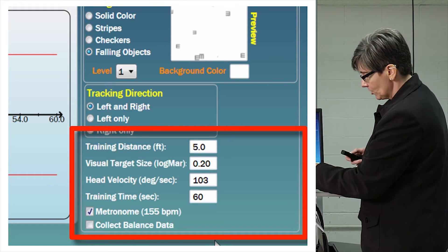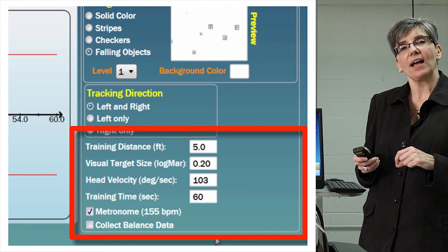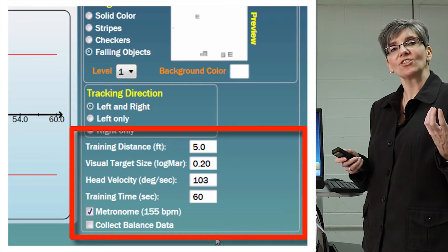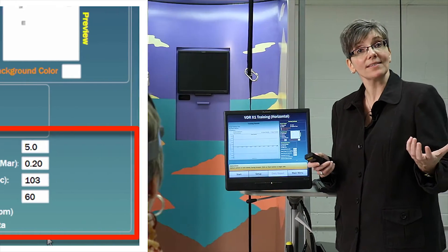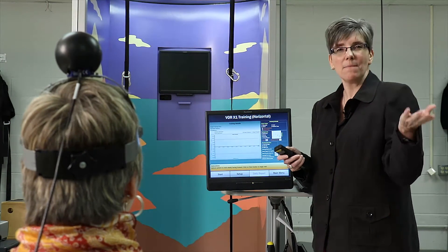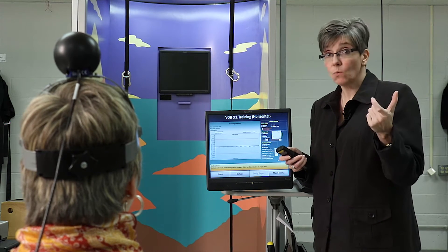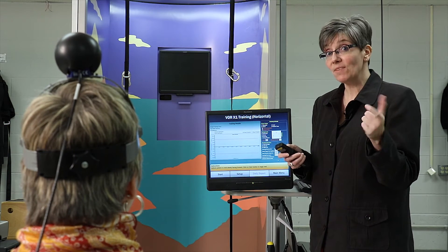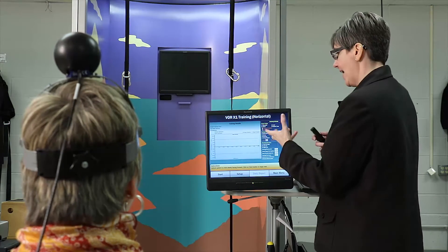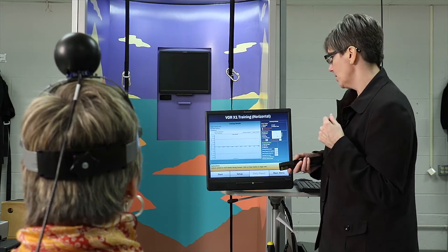If we use a metronome, it's going to be set at 155 beats per minute. That calculation is done for us because metronome beats per minute and degrees per second don't have a one-to-one relationship — there's a calculation involved, and in this software that calculation is done for you automatically.